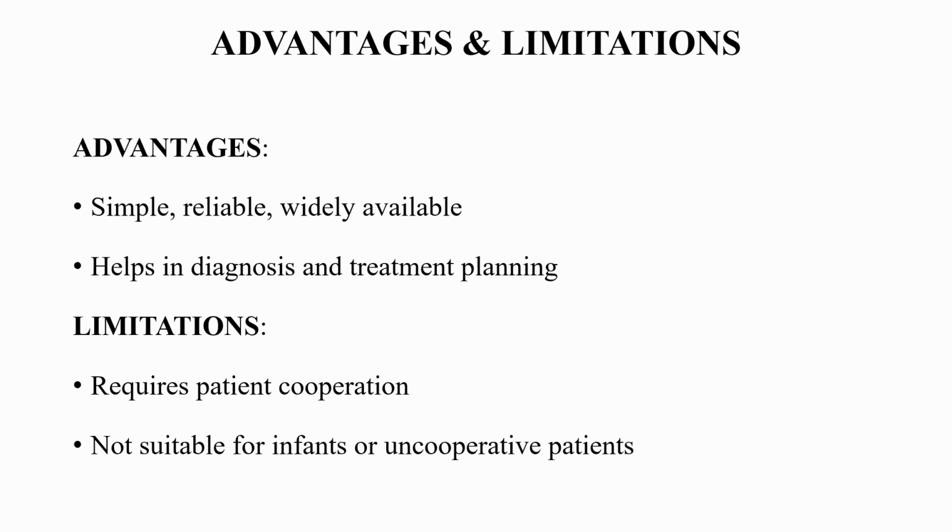And in infants, we perform other tests like BERA or ASSR while making them sleep. Small children, usually after 7 or 8 years this test can be performed, or if child is very active and understandable, then after 5 years you can perform the test. And also in children, sometimes what we do, you have to give a trial first day of the test, and then you have to repeat the test in children, small children, after 1 week, so they get better used to or understand better, and give proper response next time. But for small children, you have to perform BERA or ASSR.